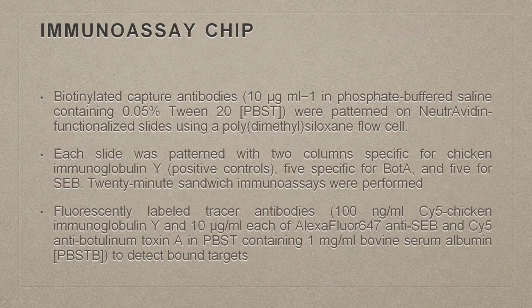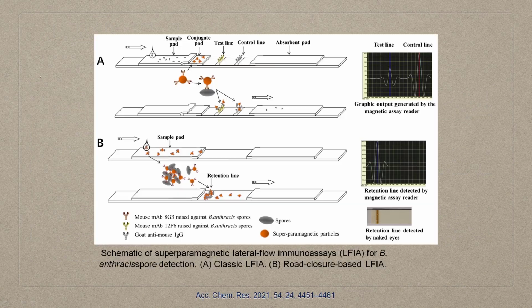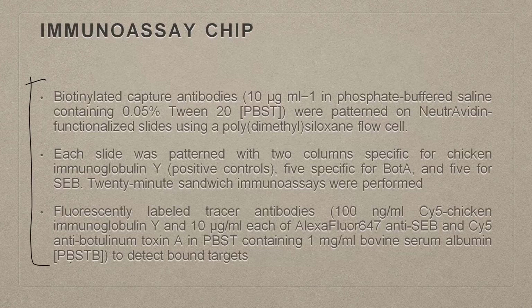Now, the immunoassay chip, what we will be discussing now, will take you to one of the sandwich chips, if you guys remember. I will just take you back to that, just to give you an idea. Just a small recap. So, we talked about these kinds of immunoassays which are being done. So, now let us visit what is the current state of the art of these assays.